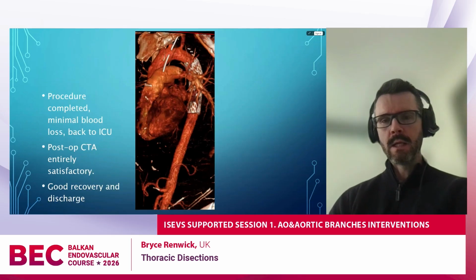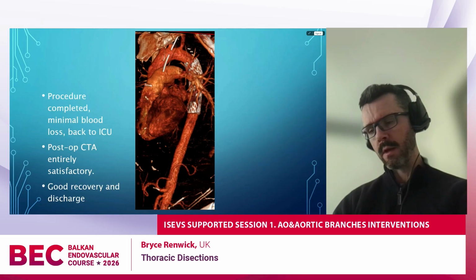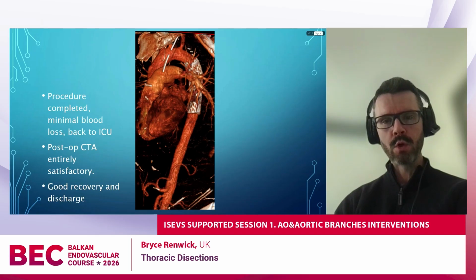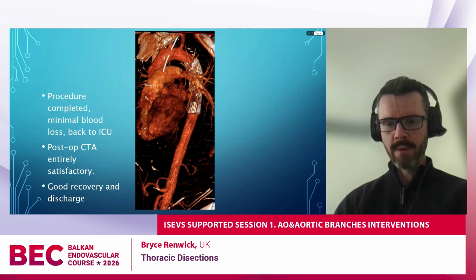And this is his post-op CT scan. This is still in intensive care the next morning. We've kept him asleep just because of the magnitude of injury. You can see the surgically repaired pulmonary artery there, very slight stenosis where the bolt's been removed, but good flow down the PA, and a very nicely positioned thoracic aortic stent graft in the proximal descending. This patient, I'm happy to say, did not require a blood transfusion and made a very straightforward recovery and discharge.